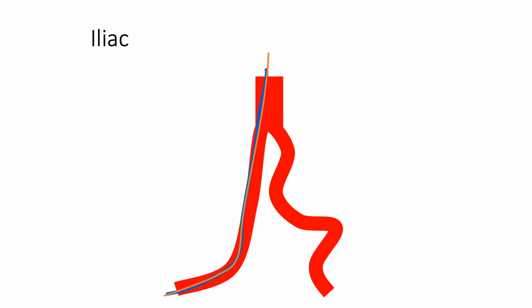And that is the problem of inability to torque or push the catheter. So the best thing for you now is to put an extra stiff wire in the catheter, take out the catheter and replace it with a long sheath. I hope you got the idea. It is now much easier to work because there is no tortuosity in the vessel. You replace the tortuous vessel now with a long sheath.